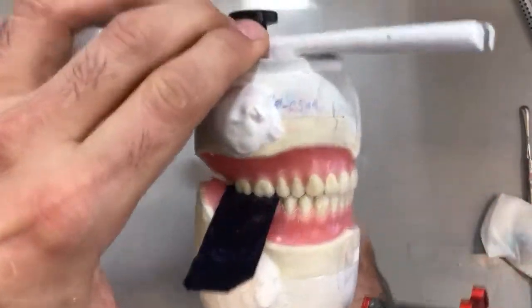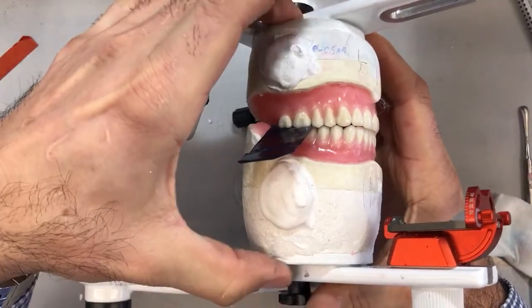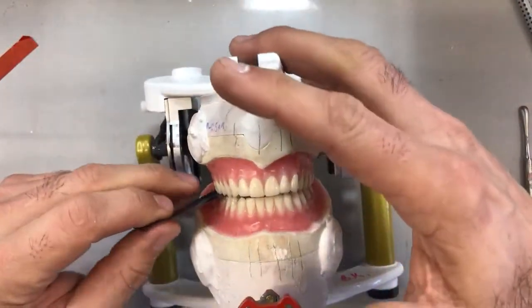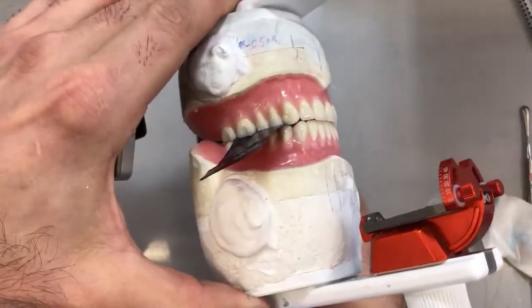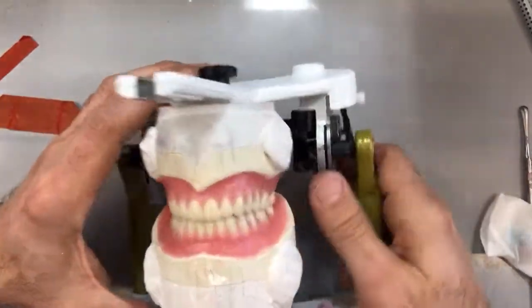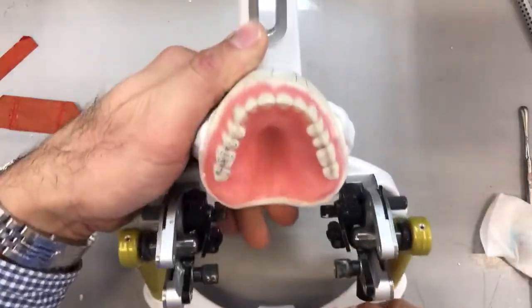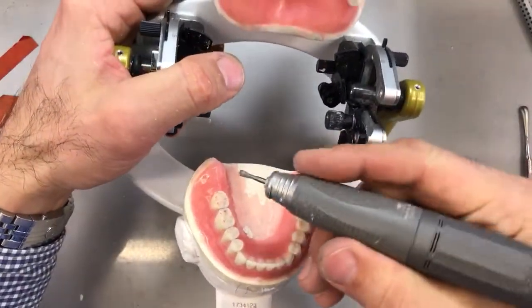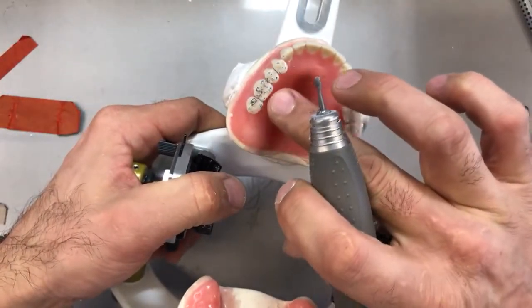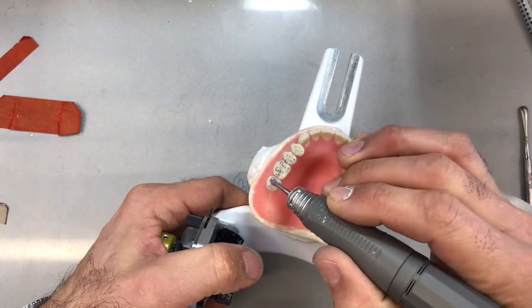Once again, I'll place the articulating paper between the molars initially, put a little pressure, squeeze the case together, and do that same lateral movement. Doing a visual check — my balancing is still not together, so there's no point placing the articulating paper over there. Opening it up, I have a lingual interference on the incline here. Remember, I don't want to reduce these cusps — these are the centric holding cusps on the opposing arch: lingual on the uppers and buccal on the lowers. So we follow our BULL rule.